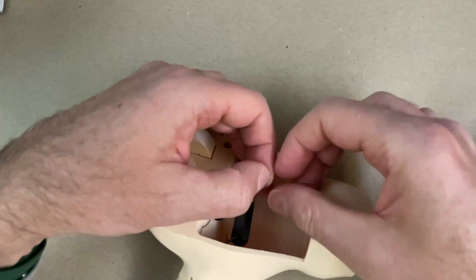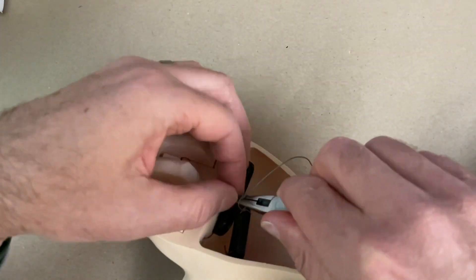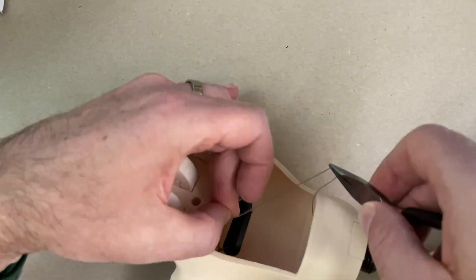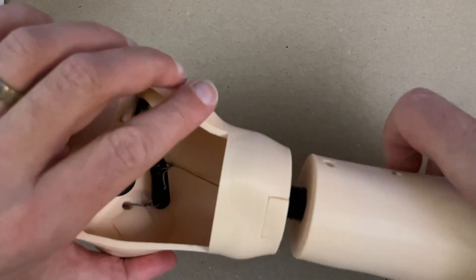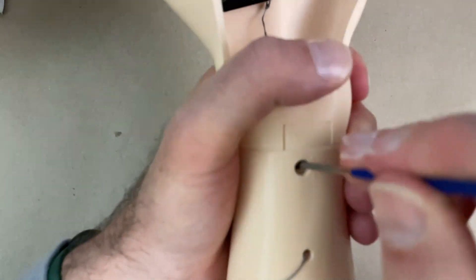Now I'm just going to tie this off at the top of the whipple tree. I'm going to put some CA glue on that to hold this knot, and then screw this arm and hand back together.